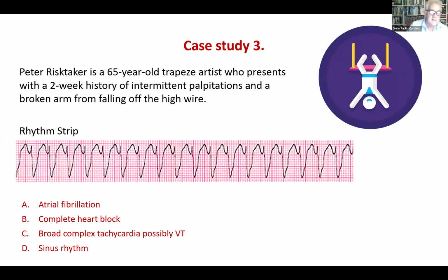Look, I think if you find there's lots of electrical interference, you could try that filter. It won't really interfere too much with the accuracy. If you're happy with the trace, it's still fine. It should be at 25 millimeters a second. Most things are standard, which you shouldn't change. If there is a filter, you can use it if you're having problems with interference. But if you can avoid using it, you don't have to use it. Ideally, you shouldn't need it.